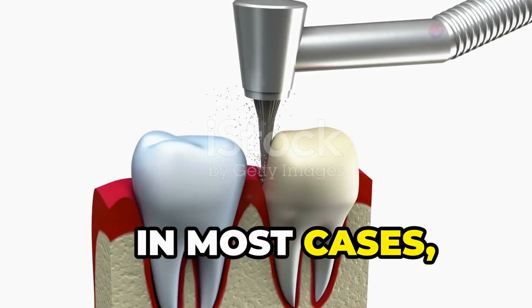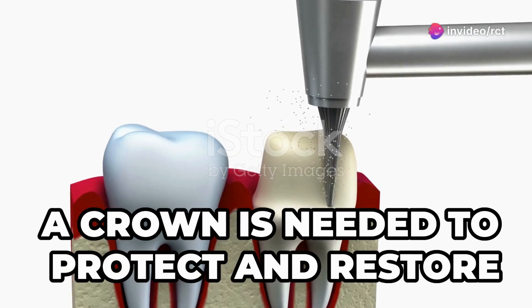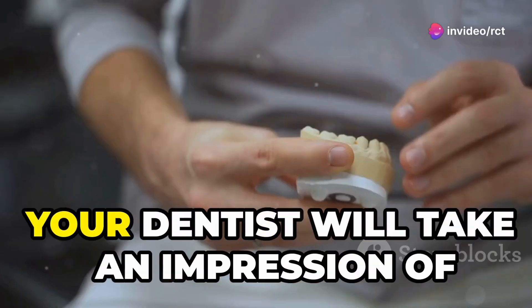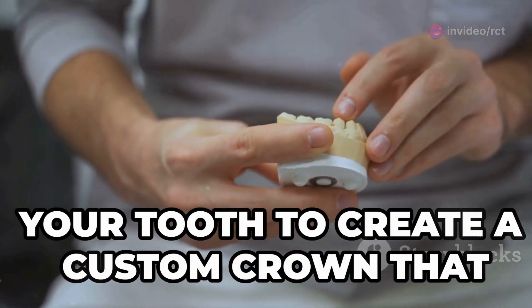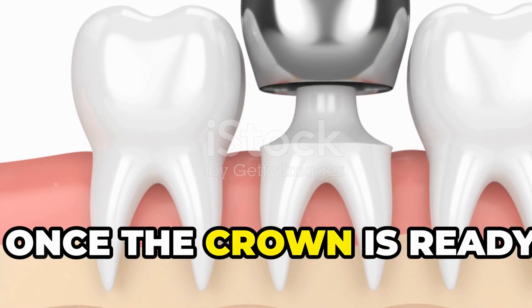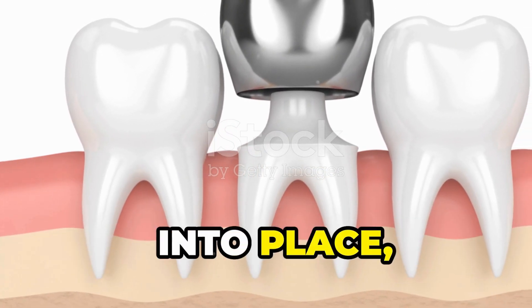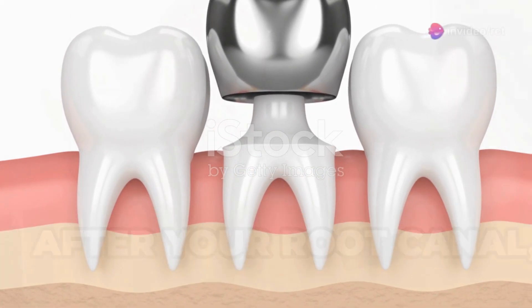In most cases, a crown is needed to protect and restore the tooth's function after a root canal. Your dentist will take an impression of your tooth to create a custom crown that fits perfectly. Once the crown is ready, it is placed over the tooth and cemented into place, providing strength and stability.